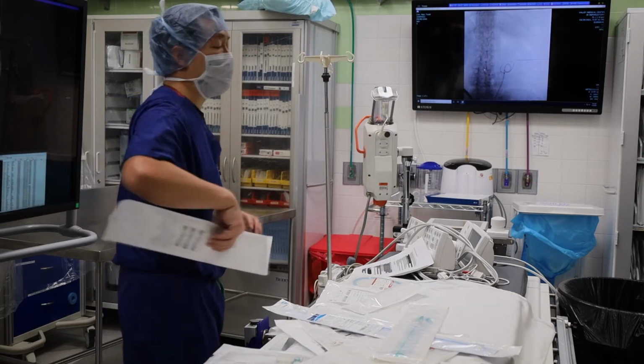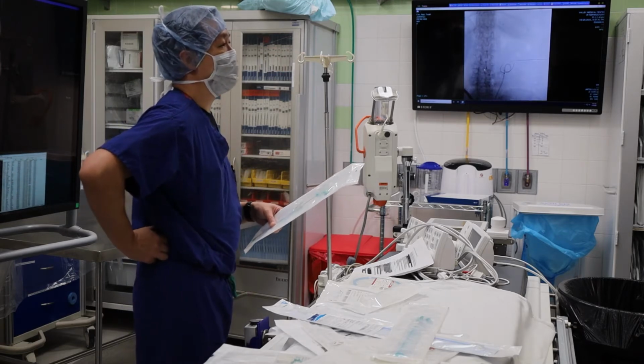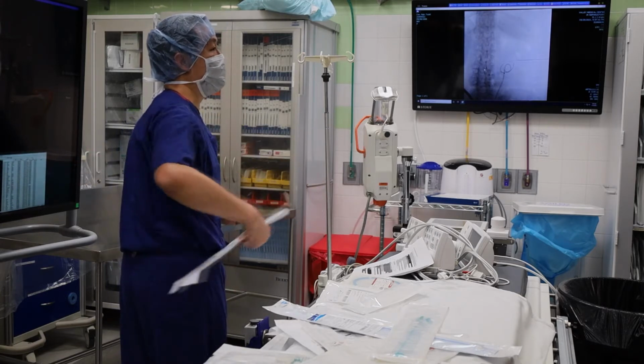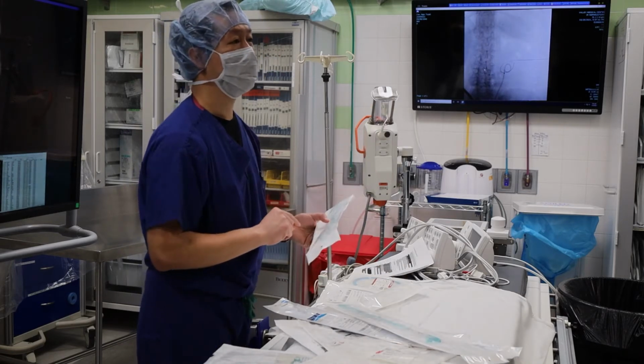And the other thing is that the kidneys move up and down when you breathe. Okay? The outside world does not move up and down when you breathe, but inside does. So this tube is technically getting dragged in and out and in and out every time you breathe. Length is great. Plus, what do we attach at the end sometimes?